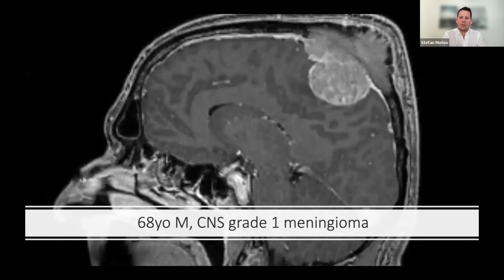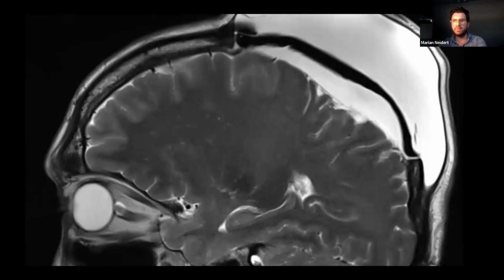All right. So this is a patient with a transosseous growing meningioma. We took out the tumor and then also had to take out the bone. So we closed up the dura with Duragen and then Palacos flaps, and then this patient came back to the hospital 3 months later and had this huge pseudomeningocele, and that was even growing over time. And we tried all the mentioned techniques except for the lumbar drain.